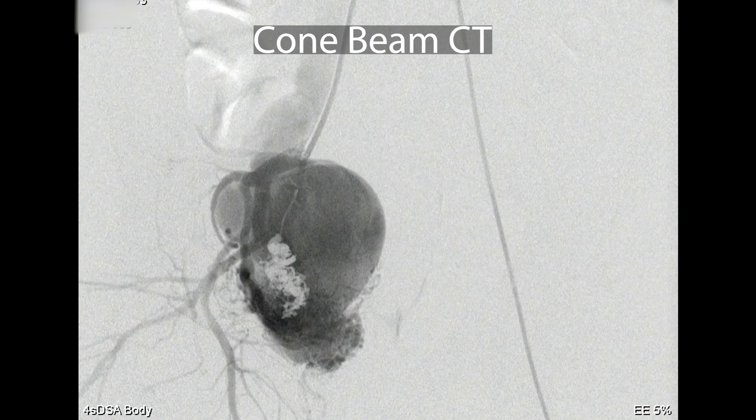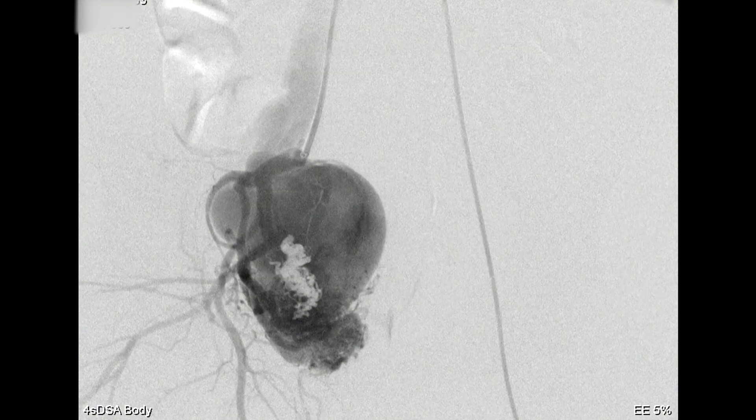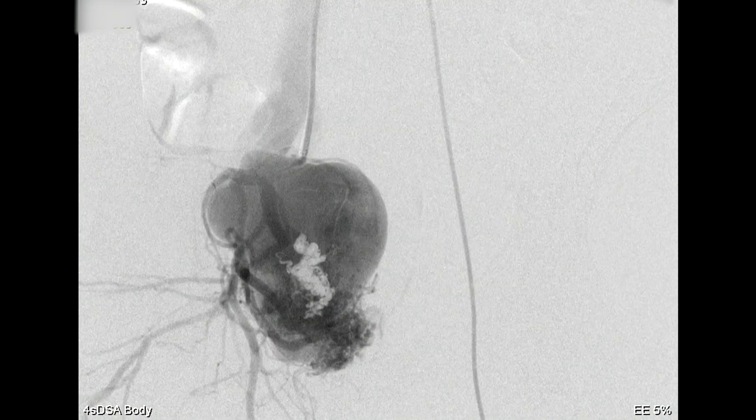Most of that is the venous aneurysm. I used to always worry about thrombosis with these, but I've never actually seen that happen. Even if you do fairly aggressive embolization, there's always still flow coming through. Typically you want to follow them and see if it gets smaller — I kind of expect it to. Then if it doesn't, you make a decision about whether you're going to tackle that.